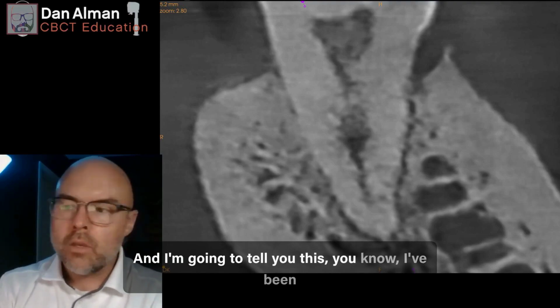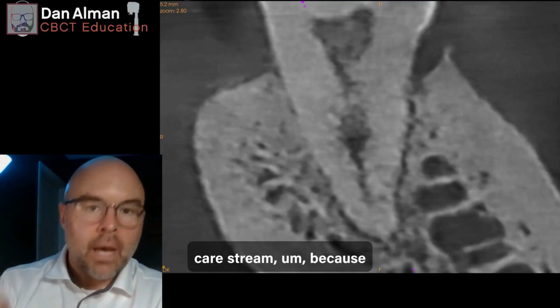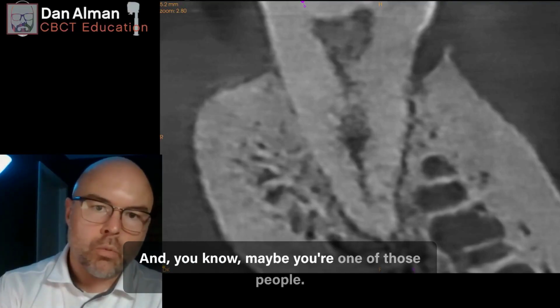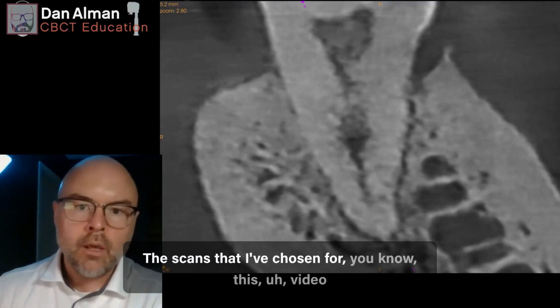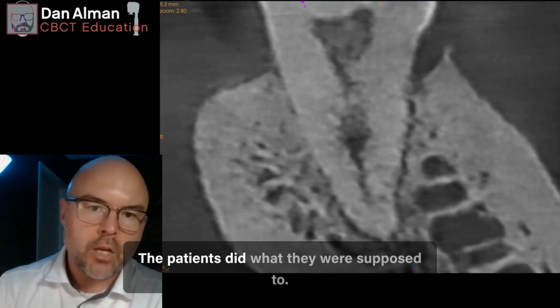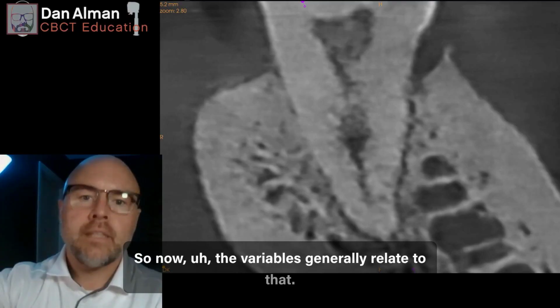And I'm going to tell you this. I've been doing this for a while. I get a lot of general dentists that come to me, and they're looking at Carestream because they're unhappy with their ability to see canals in their CBCT scans. And maybe you're one of those people. Now, there are some variables that are involved with that. The scans that I've chosen for this video are very well acquired scans. The parameters were good. The patients did what they were supposed to, and they're good scans. So now the variables generally relate to that.